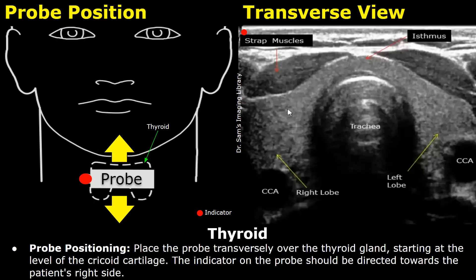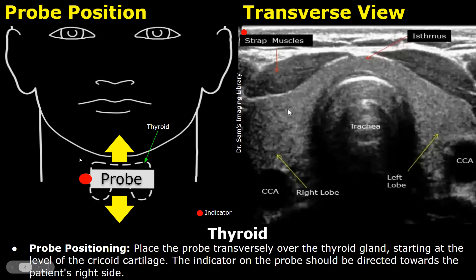Place the probe transversely over the thyroid gland in this manner, starting at the level of the cricoid cartilage. The indicator on the probe will be towards the patient's right side, and you will get this type of image.